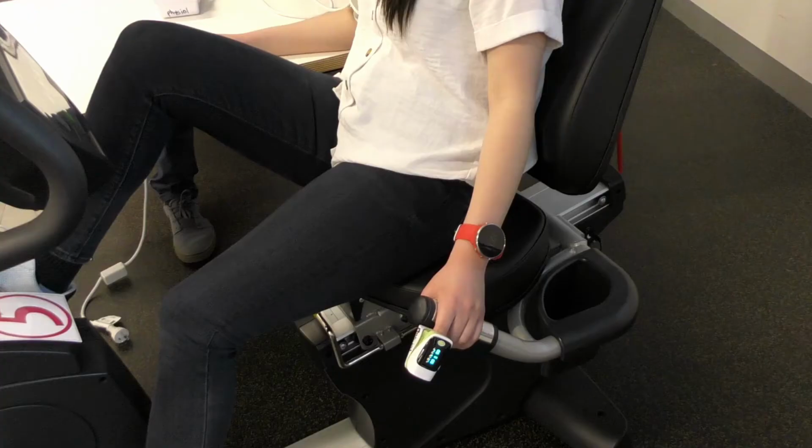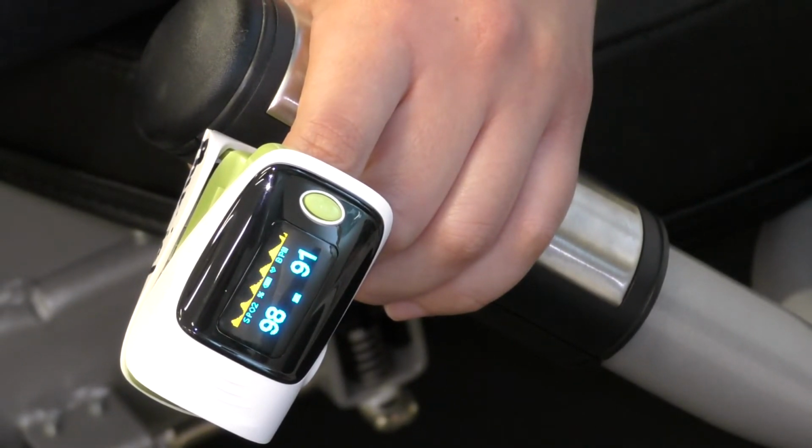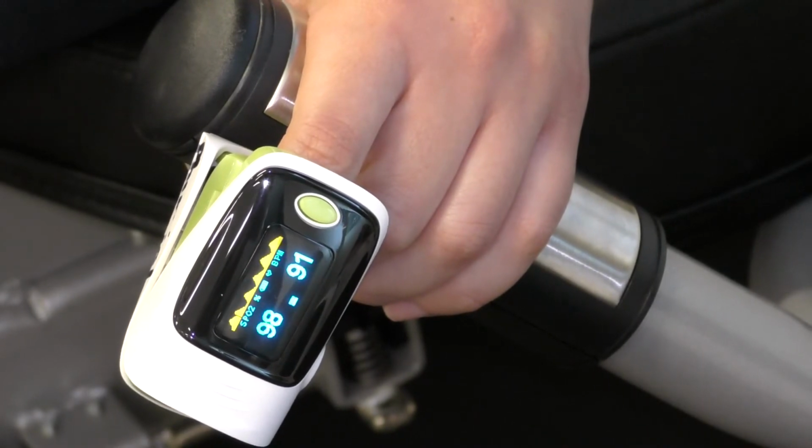And then we'll put the pulse oximeter on the index finger of the left hand so it can be accessible to our data recorder on the other side. This will obviously allow our data recorder unhindered access to record heart rate and oxygen saturation across the 25-minute period.